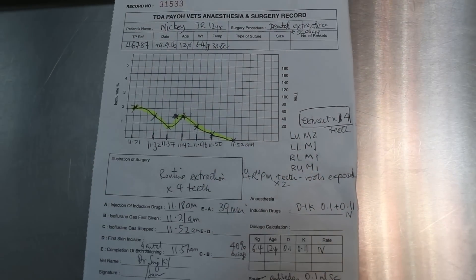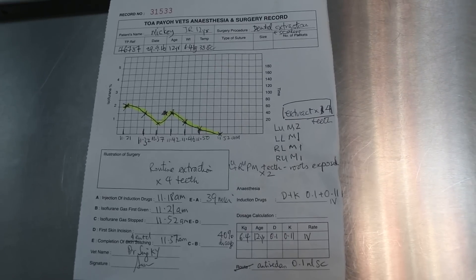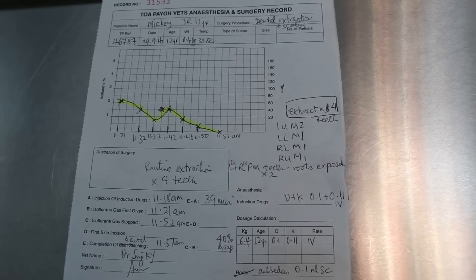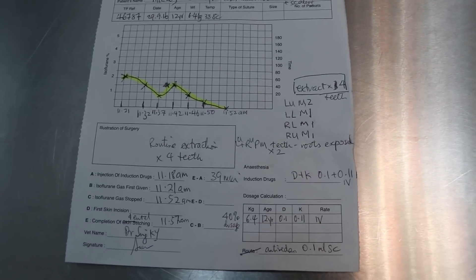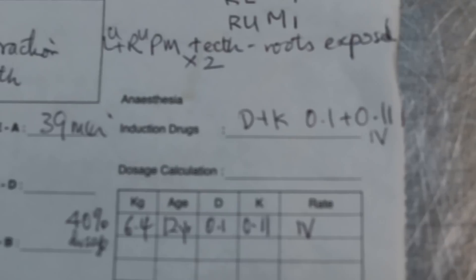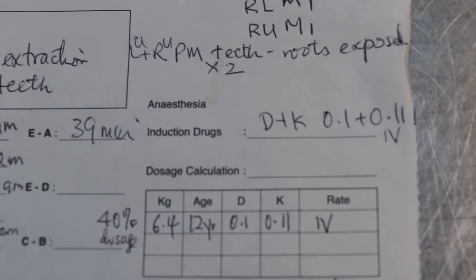It's September 29th, 2016. The Jack Russell, 12 years old, has been anesthetized, intubated, and four teeth have been extracted, as you can see. This is the anesthetic and surgery records. We find this drug — Domitor plus ketamine — to be very, very safe.